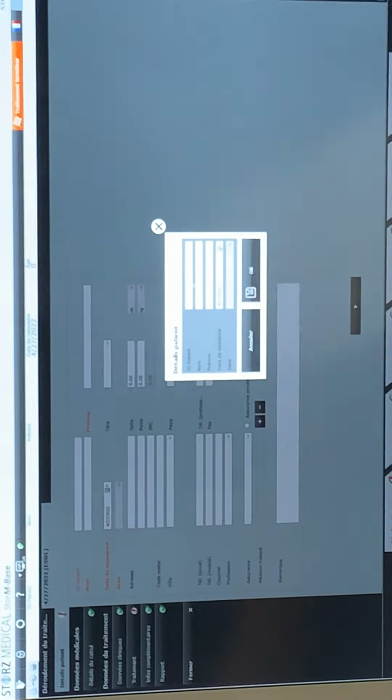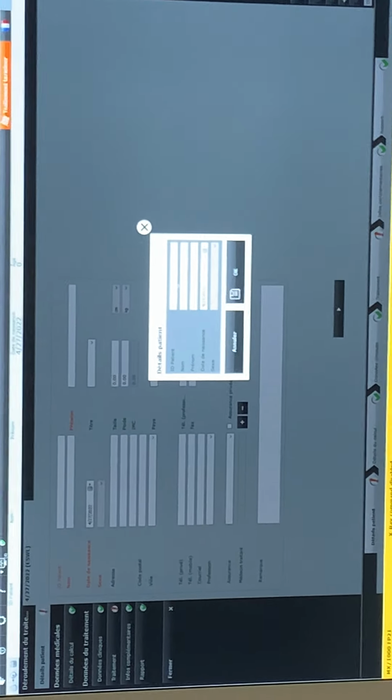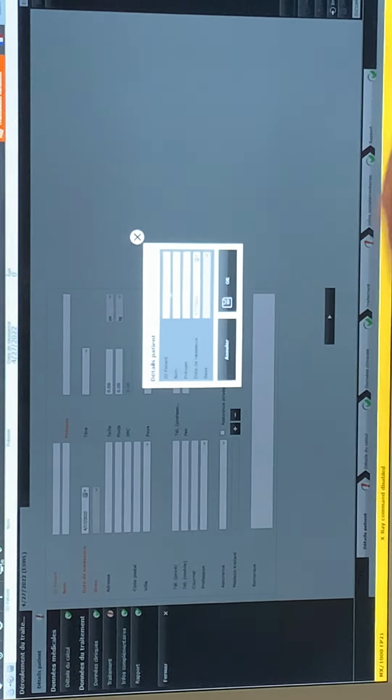And you need to enter the details for the next patient. This is if you want to do it offline, if you do not have a worklist entry. But then please be informed, you cannot send the images to your PACS. You will get problems with your PACS people. So the text has to be putting a new patient. If there's an add-on during the day, you have to put it in the system. And you always need to choose it.